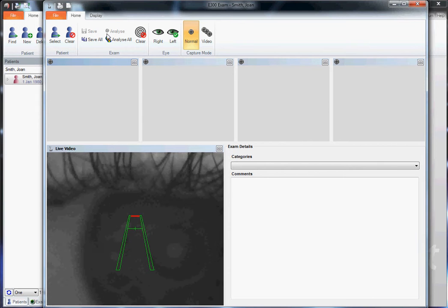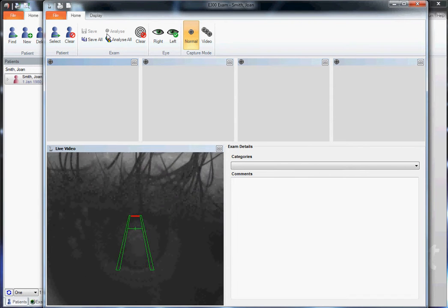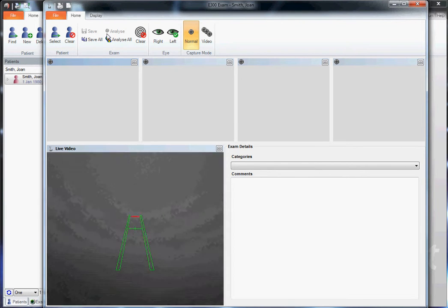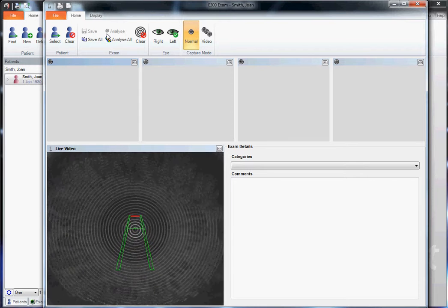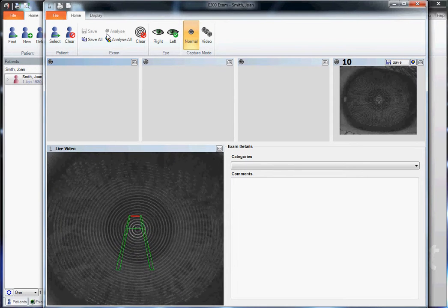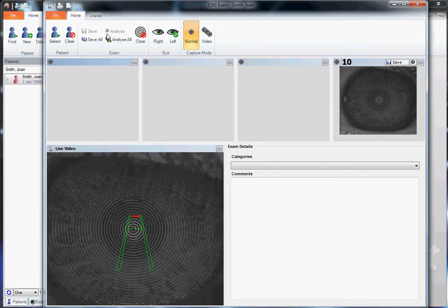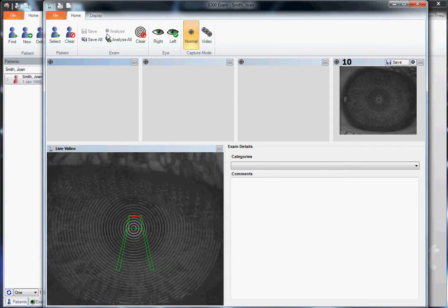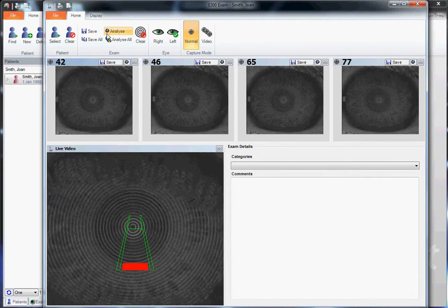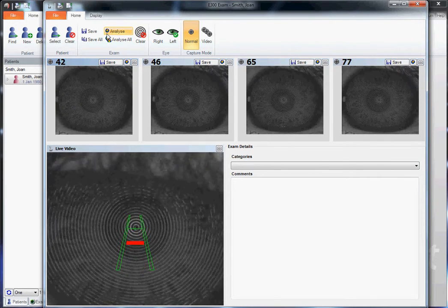Make sure your patient is seated comfortably, then center the instrument to the apex ring of the eye. The red line tells us how close or far away we are from the patient. When the red lines are at the top of the runway, we are too far away and need to move closer. When the red lines are at the bottom of the runway, we are too close and need to move back.